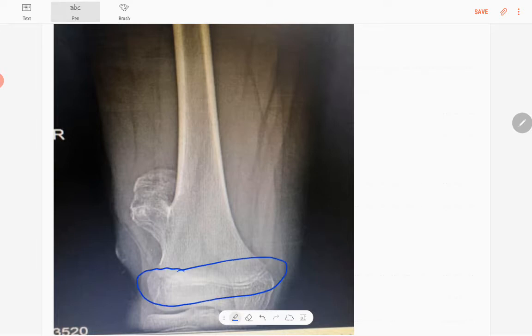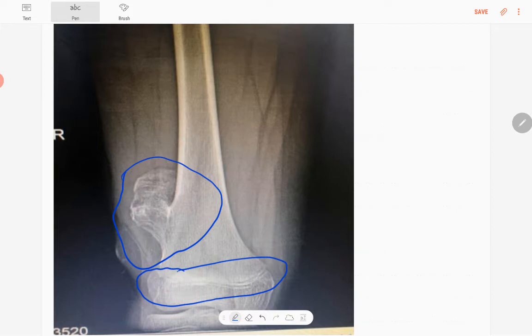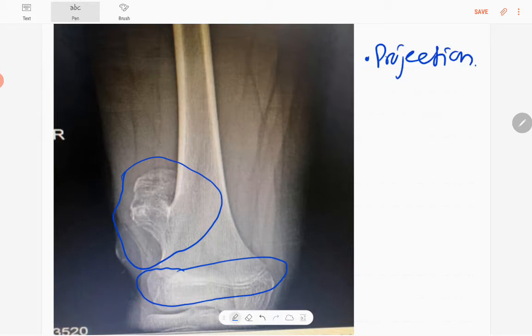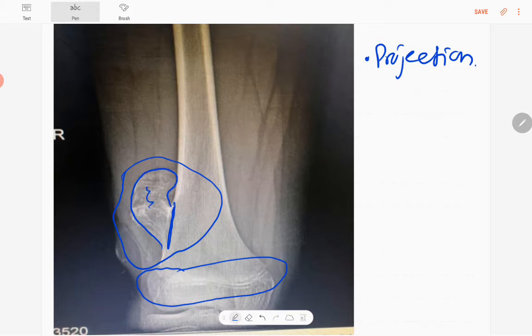You can see the growth plate is not fused, confirming skeletal immaturity. The abnormality here is a bony projection which arises from the lateral aspect of the right distal femoral metaphysis. It is well-defined with a narrow zone of transition. The cortex is continuous, and the medullary cavity is also continuous with the native bone.